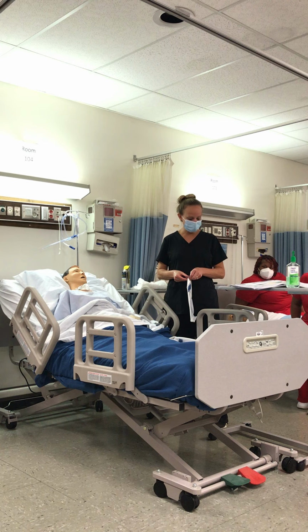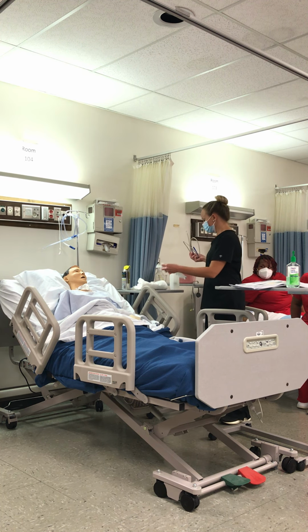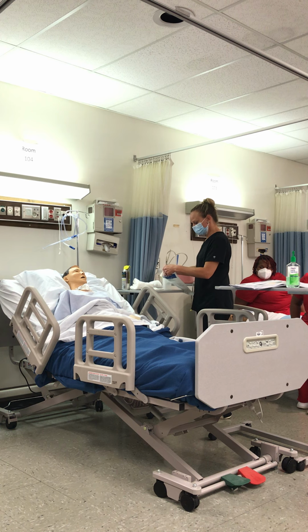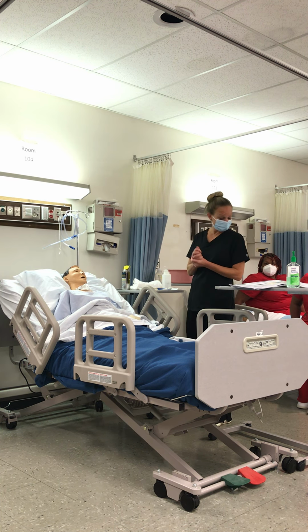So it's talking about unwrapping and coiling this tube. These tubes are pretty stiff. They've been packaged for what, a year or two? Three? It talks about unwrapping it. If it's real stiff or you can't get this tube to bend, what would I want to do before I touch this tube though? Put it in warm water. Wash my hands. I don't think it's on there, but you do.